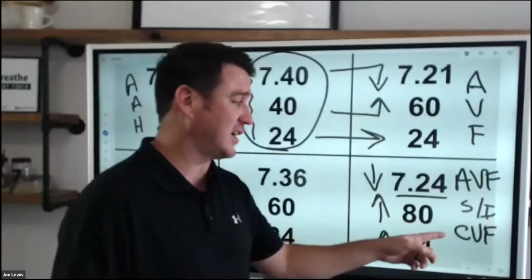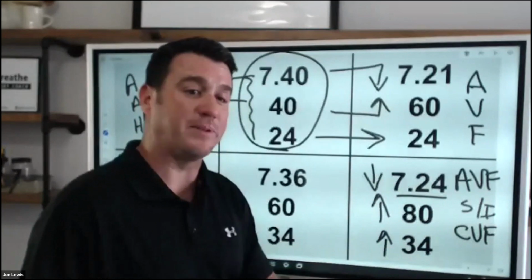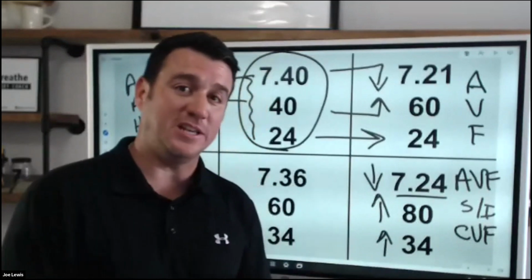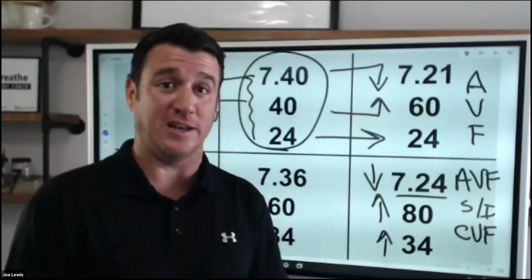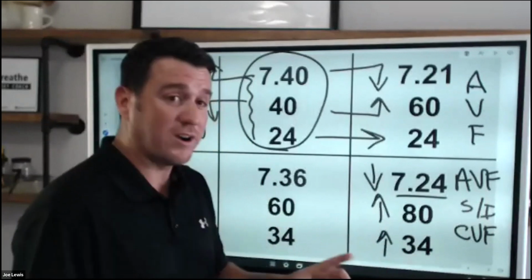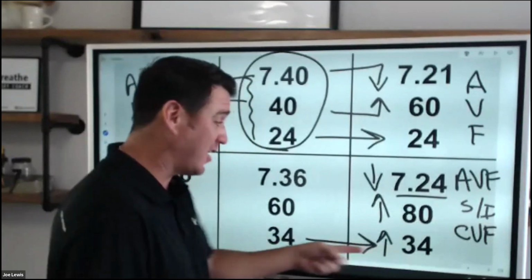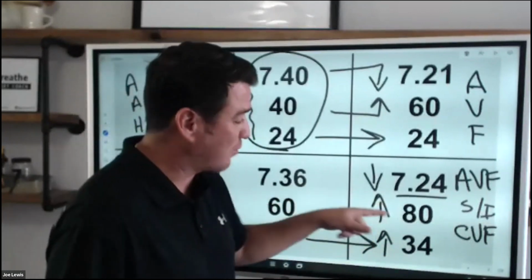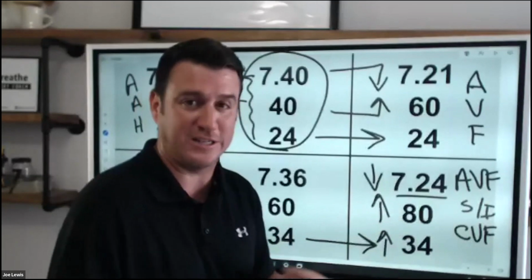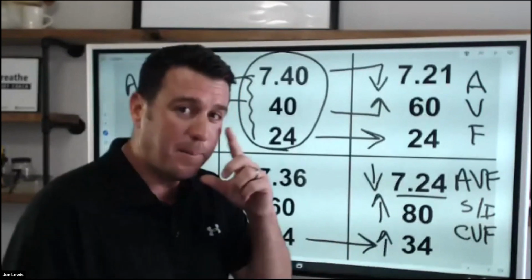Well, now let's think about this for just a second. If we interpret this traditionally, we would say partially compensated respiratory acidosis, which gives you the illusion that there is compensation in the works because it's partially compensating. Or maybe you just called it compensating respiratory acidosis, but not really. There's really not any compensation that has begun yet, because look, it's an acute problem. So our bicarb has not begun to respond to that rise in CO2 to 80. So you can't justify this as a partially compensated respiratory acidosis. That's probably right in the test, but we know better.